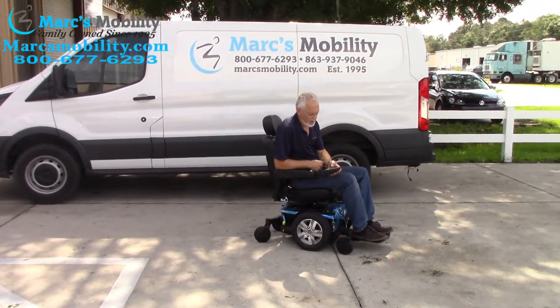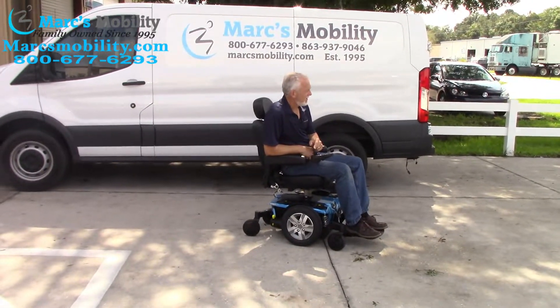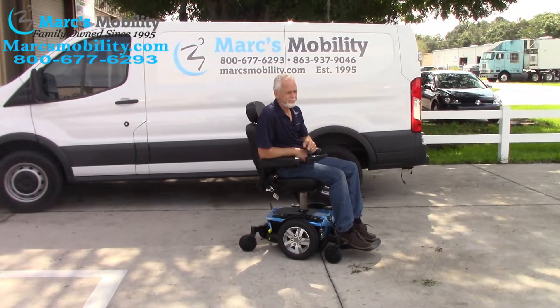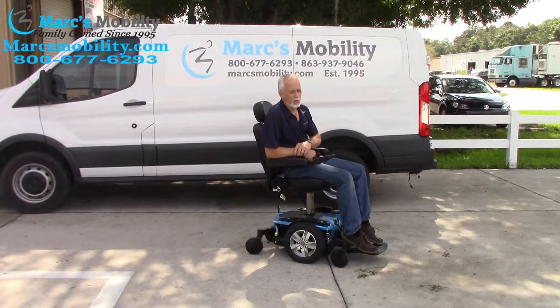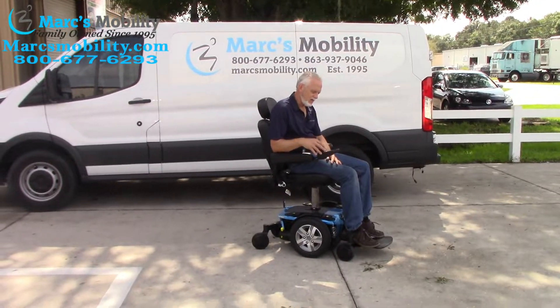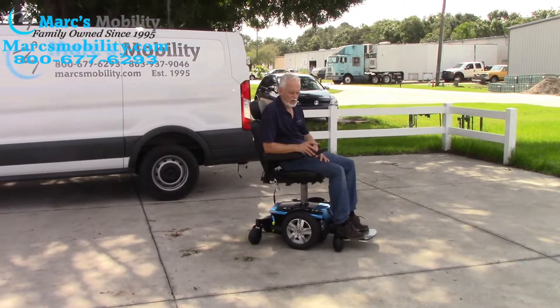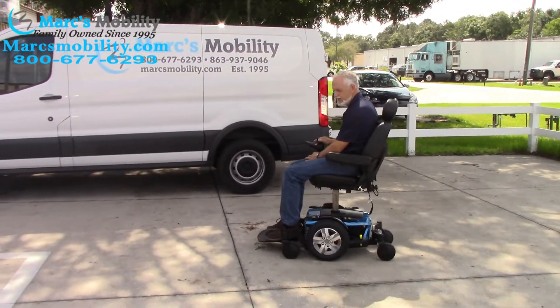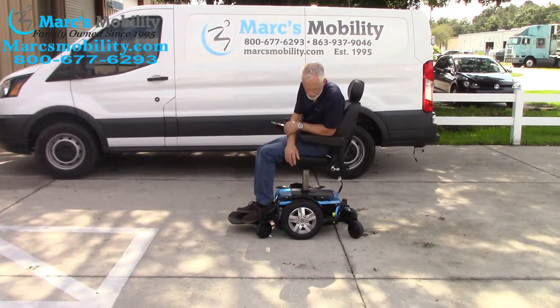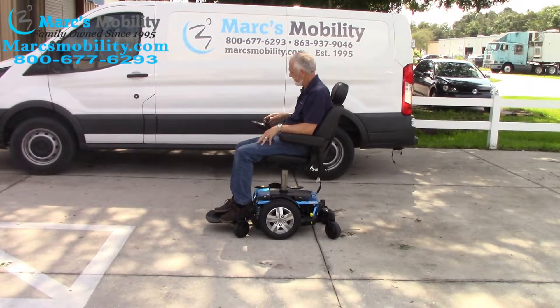This is the Quantum 6 Edge 2.0 with the seat lift. I'm going to make the seat go up right now — six inches. When elevated all the way up it was at 28 inches. If you put it back to drive, yes, it will drive with the seat elevated, but at a slower speed. So if you're looking for a chair with a six-inch seat lift — beautiful-looking chair, fast, great suspension — this is a nice one and it's ready to go.